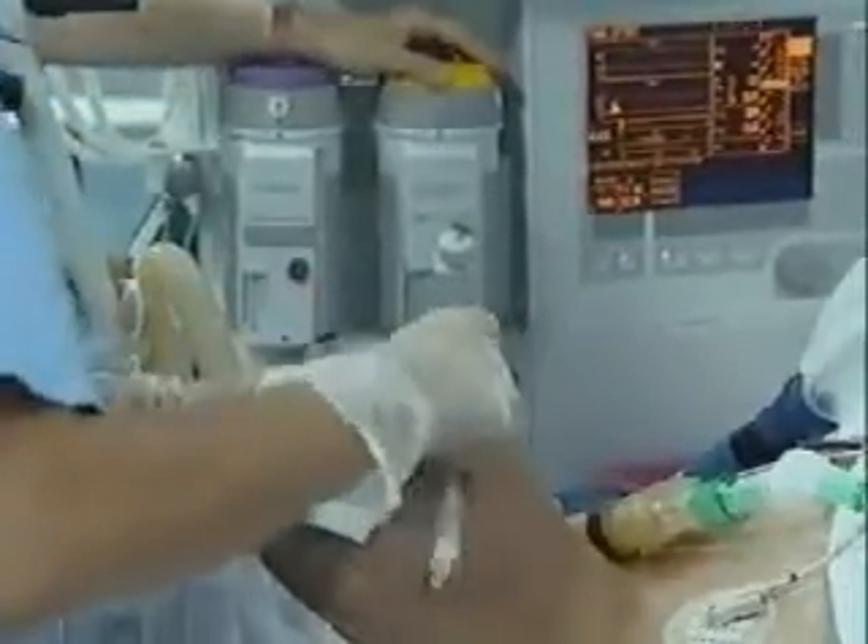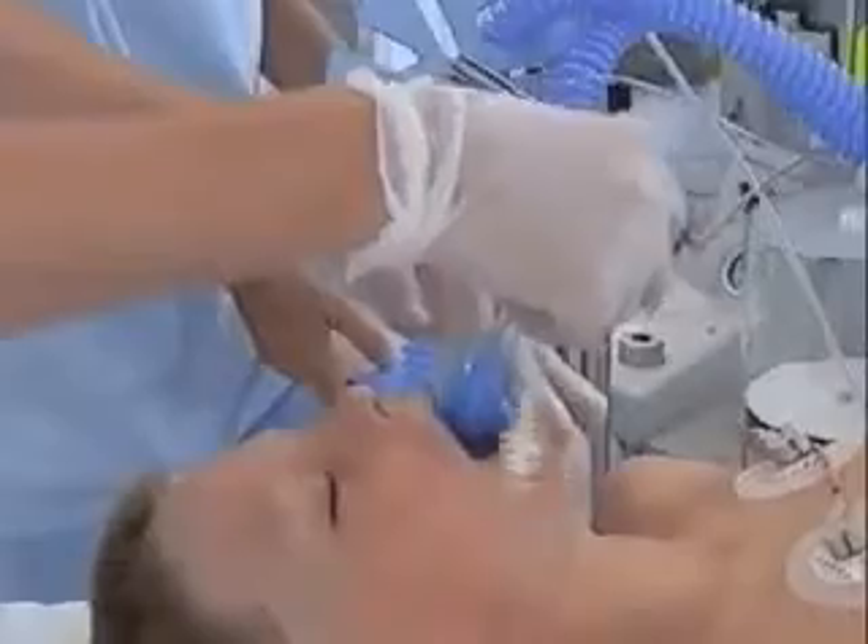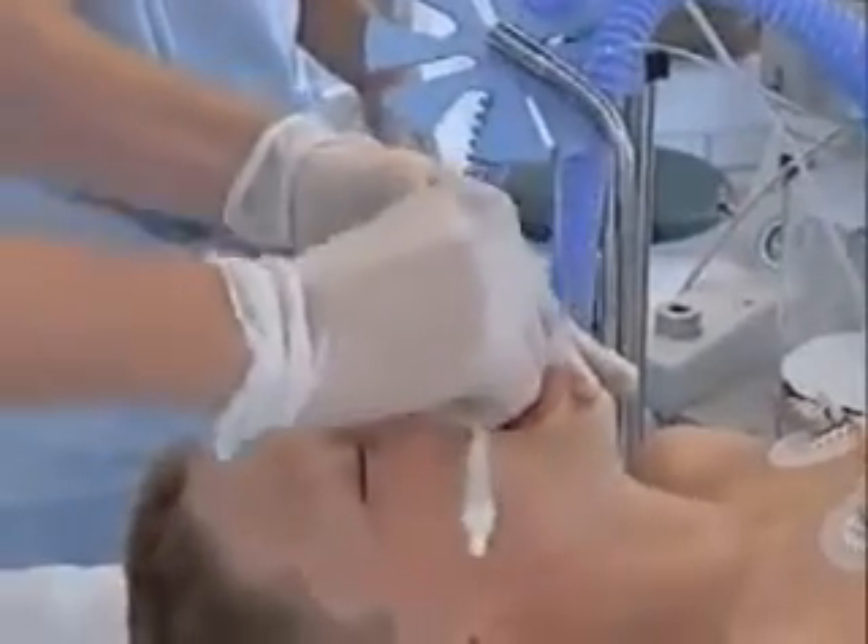The mouth is opened with the left hand and the laryngeal tube inserted in the center of the mouth until the black marks on the tube are level with the upper teeth.